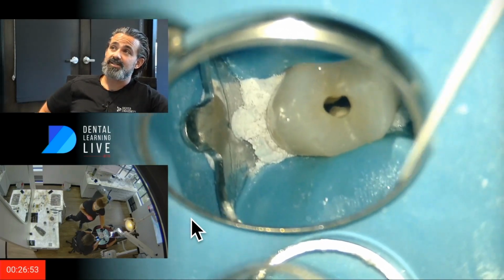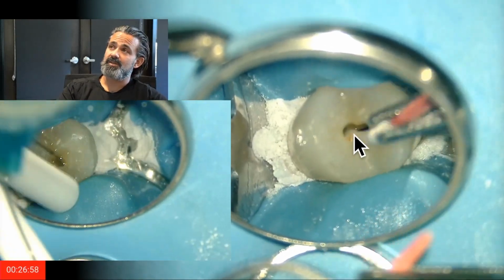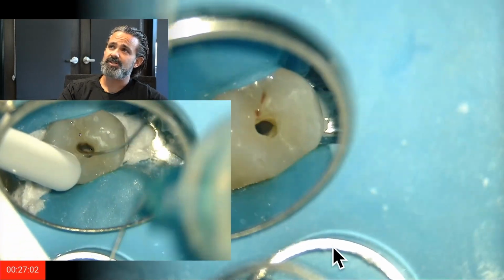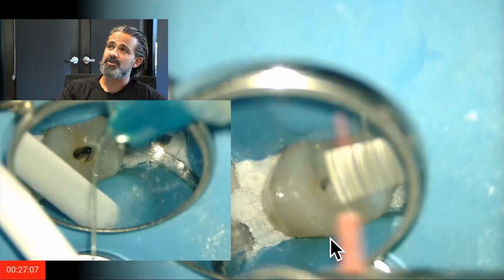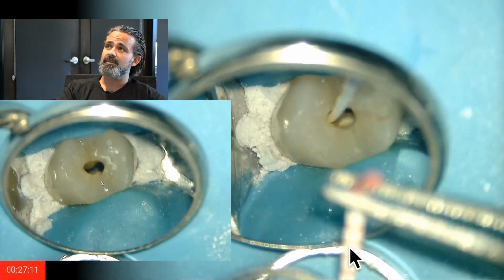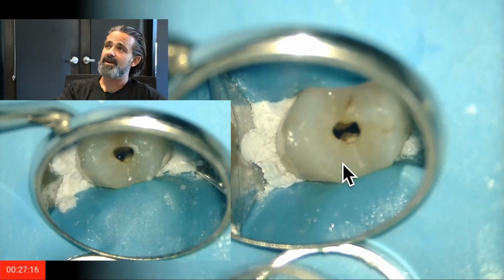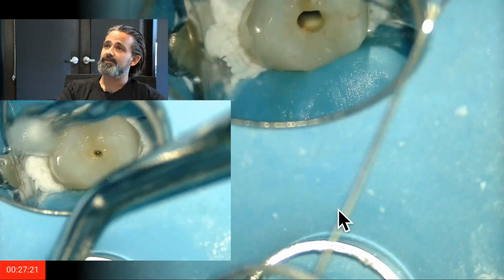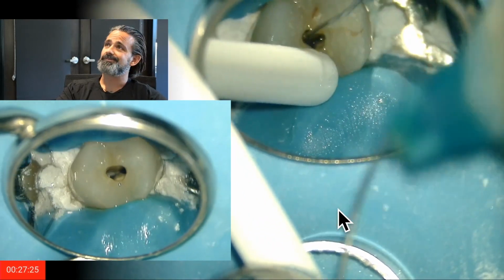You can see that that isthmus is opened much more than when I just took my instrument at the beginning, and that was a 3D shaper, by the way. I didn't do a ton of instrumentation, just enough for fluid dynamics, but it removed it. It's gone. So if you roll back in the video, you can superimpose. In fact, maybe I'll take a screenshot before and after of that and just put them side by side here for you. But you can see that that isthmus is open. So isthmus clean and the bicuspid.